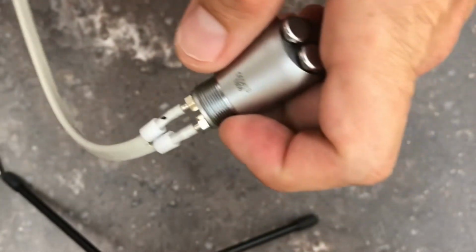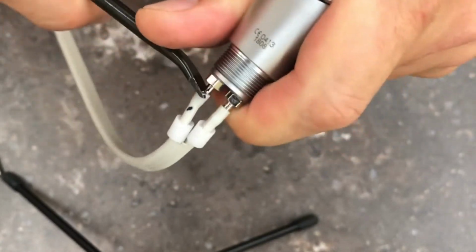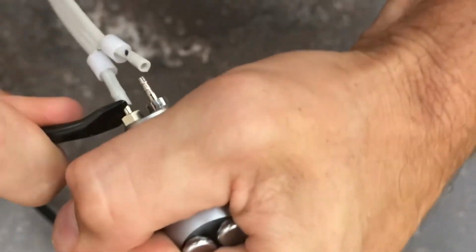Next, use a flathead screwdriver to push down the nylon collars that are retaining the tubing onto the syringe. From there, just use that same flathead screwdriver to pop off the tubing.